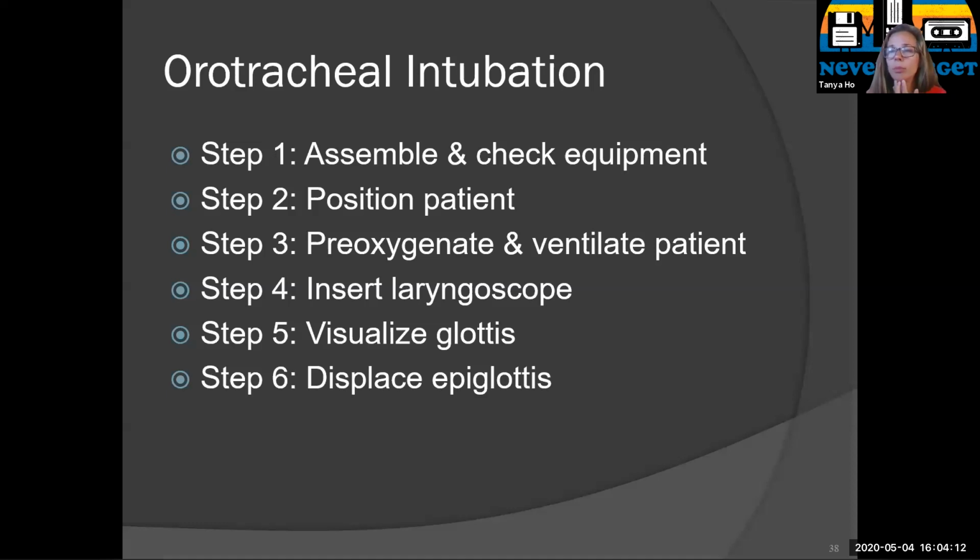And the way you can remember the color changer is that it's purple and gold. So if you're in, it's golden. Gold, you're golden. Okay. I forget what the P one is, but if there is CO2 detected, it will change from purple to gold. And then that means you're in.